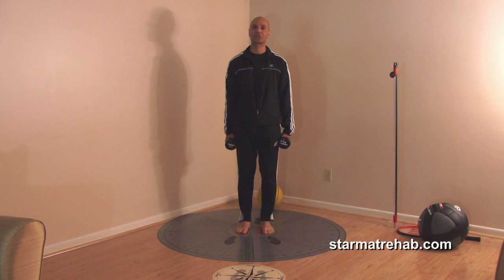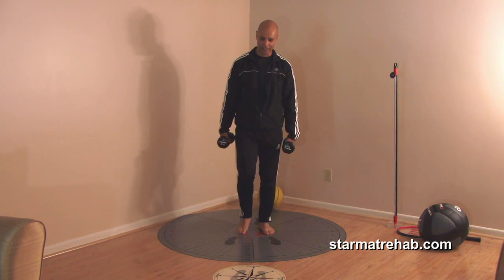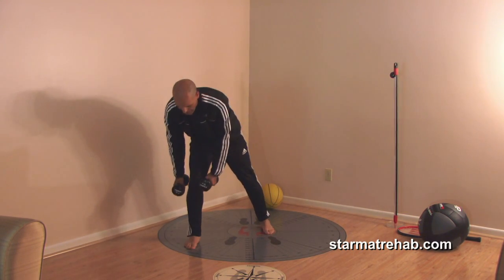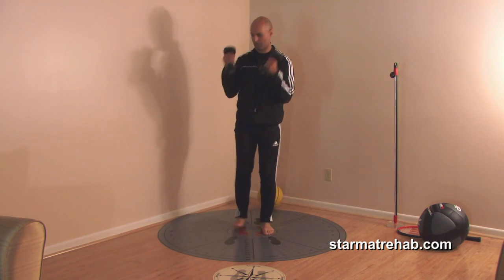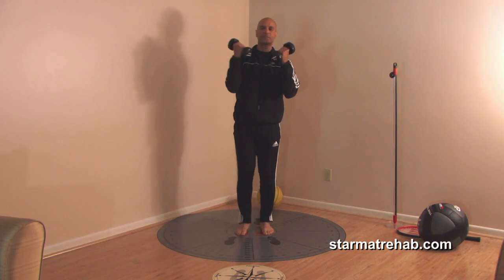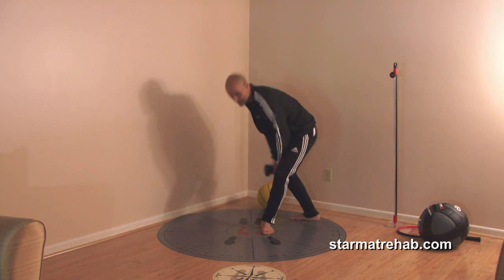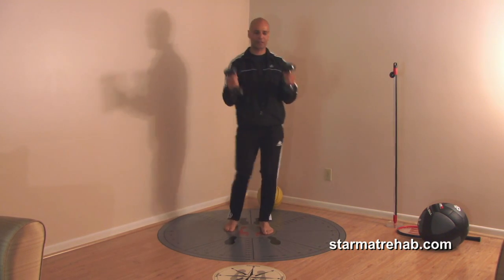Next, if you really want to activate the gluteus maximus and medius, it's called bend forward to the knee. Bend forward to the knee and come back. You can do a bicep curl — anteriorly, bicep curl; lateral, bicep curl; posterolateral, bicep curl. This is one of the better ways to activate the gluteus maximus and gluteus medius in every plane of motion rather than one plane.